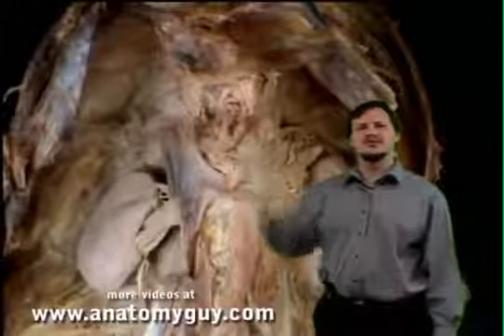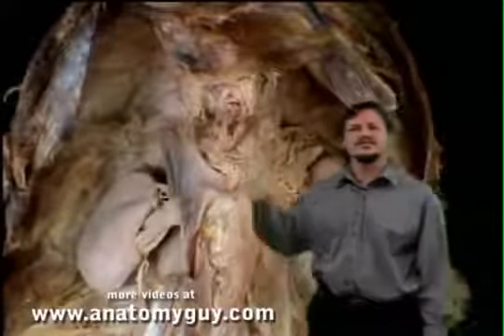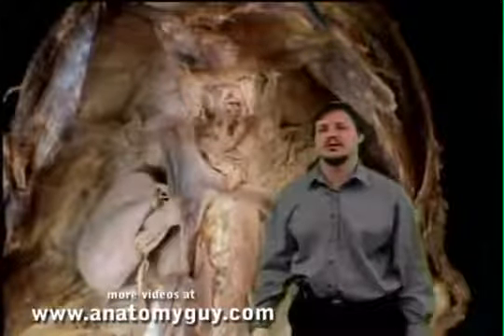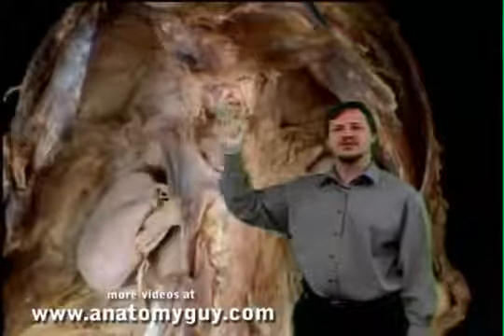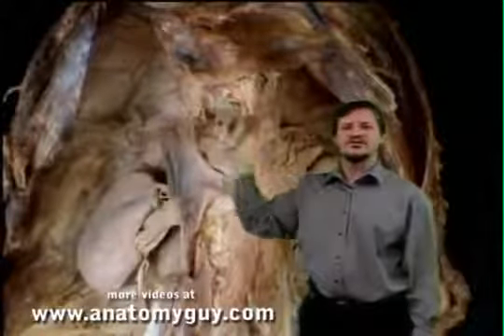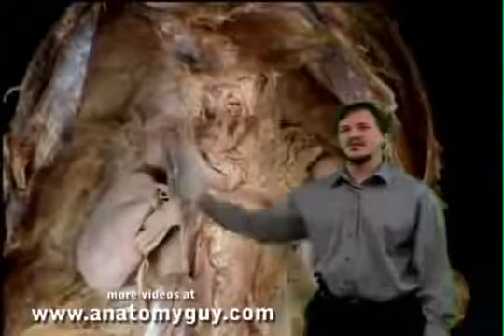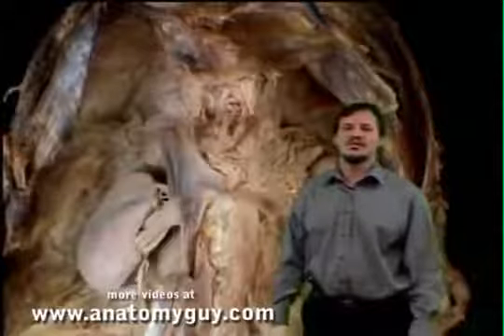Remember, the aorta on the abdominal side is going to begin after it passes behind the thoracic diaphragm at the level of the T12 vertebra. We can even see the esophagus right in here that's passing through the diaphragm in the crus at the T10 level. The IVC would be going through at T8. Now let's zoom in a little bit more and look at some of the branches of the aorta.